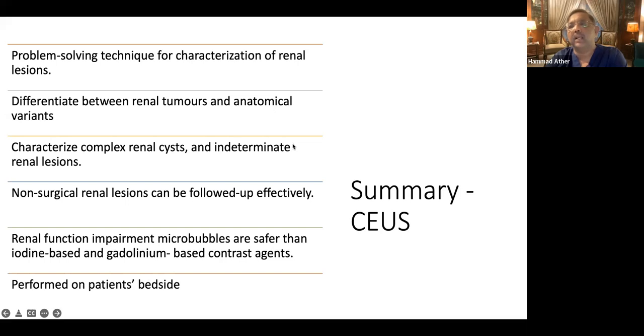The typical evolution of tumor is such that if you have a 2F cyst with very thin septa or very subtle enhancement, which is not in the suspicious range, and the change in density from non-contrast to contrast is not significantly in the suspicious range, this patient would probably require a few imagings.